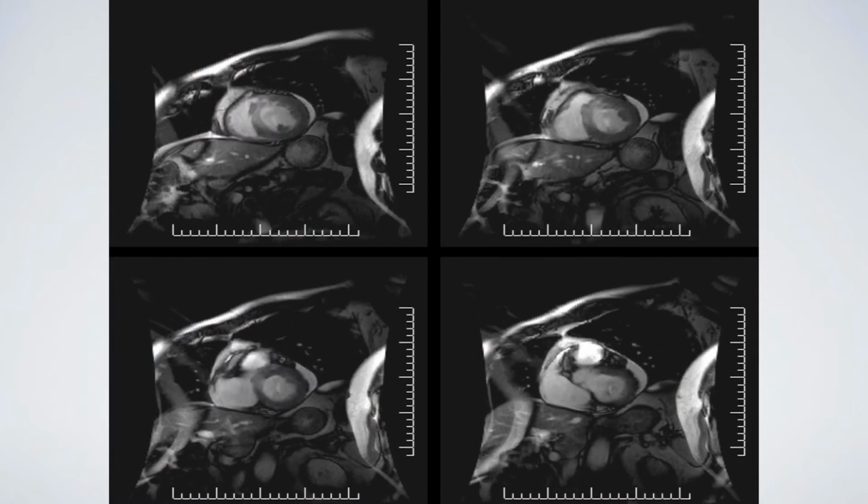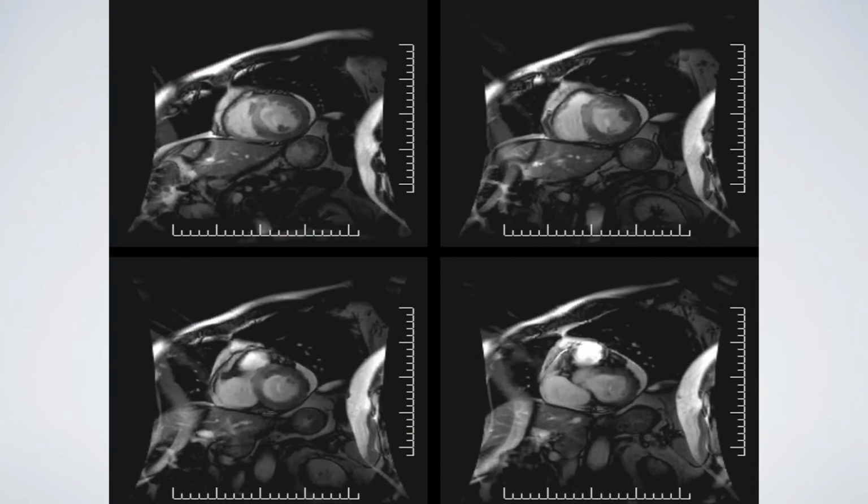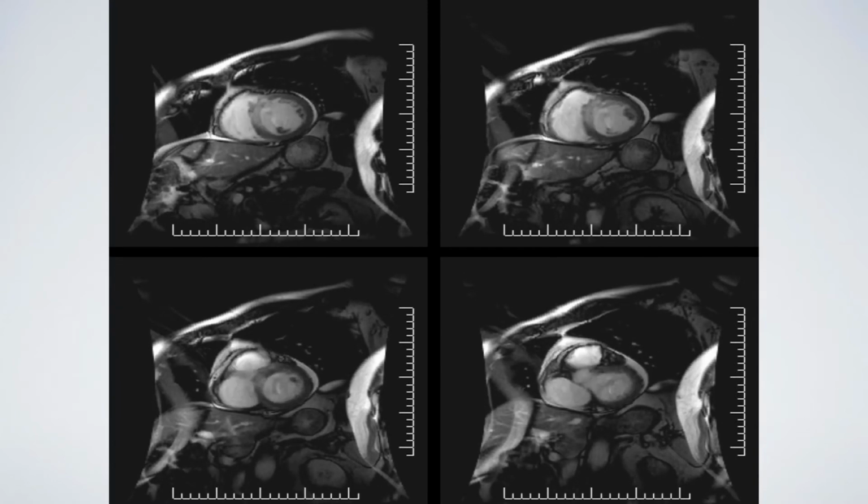So we call this a short axis, but you can just imagine we're slicing horizontally through the heart. The circular structure with the black outline is the left ventricle, and that black outline is the thick muscle of the left ventricle. The structure on one side but wrapping over it is the right ventricle. And of course you can see that the muscle layer is much thinner. The right ventricle muscle layer is almost paper tissue thin, and the left ventricle has a proper thick muscle.